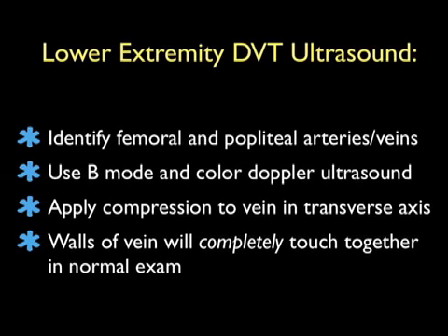We want to apply compression to the vein, pressing down with the probe in the short axis or transverse orientation. In a normal examination, the walls of the vein will completely touch together.